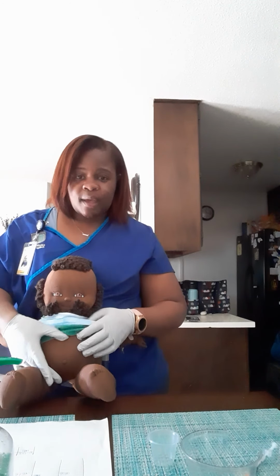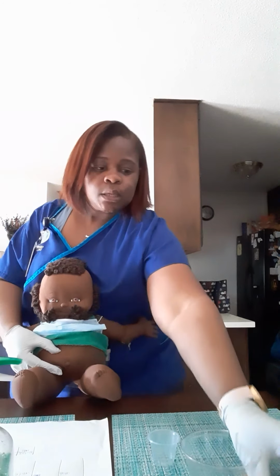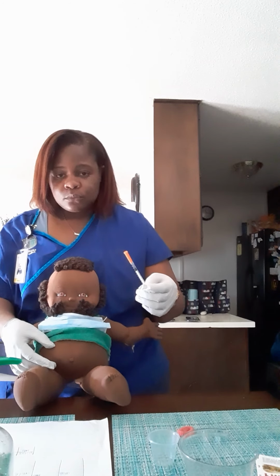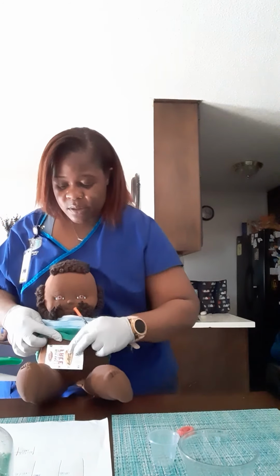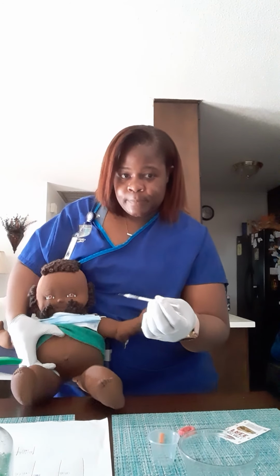I'm going to grasp the skin with my non-dominant hand. I'm going to clean the area with some alcohol. Actually, I'm going to uncap this. I've cleaned the area with some alcohol. I'm going to uncap this, and I'm going to grasp the area with my non-dominant hand.